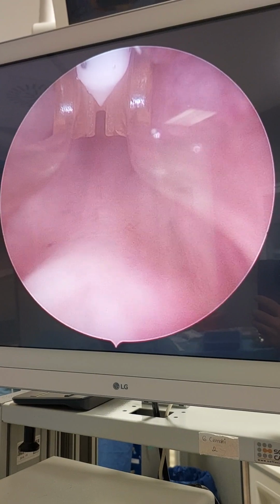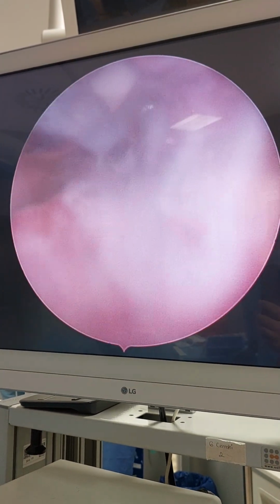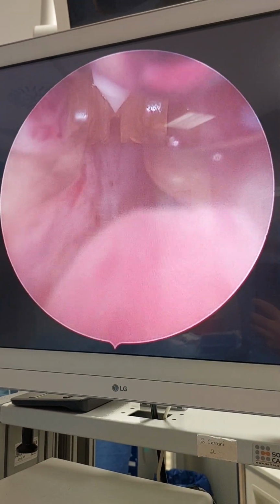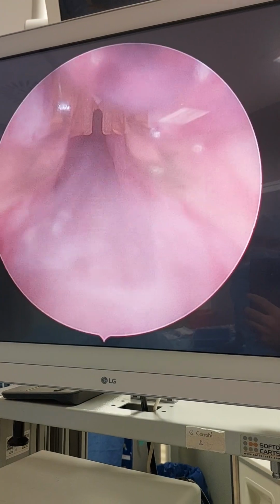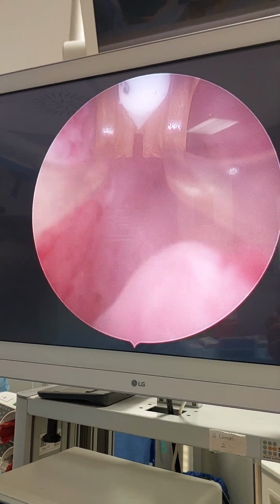He's coming from Canada just for this. It's not a very big prostate, so he's having difficulty urinating, and because of this inflammation he's having pain. Normally we do prostate massage for the treatment of infections, and the fluids coming out in the massage are those.